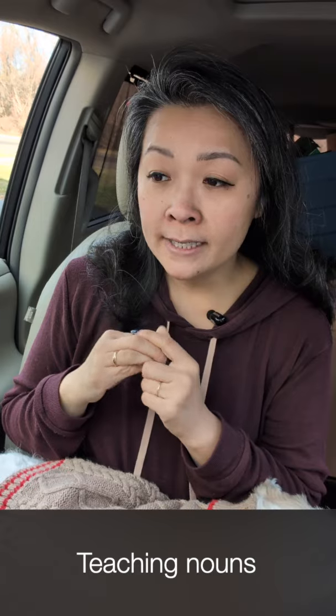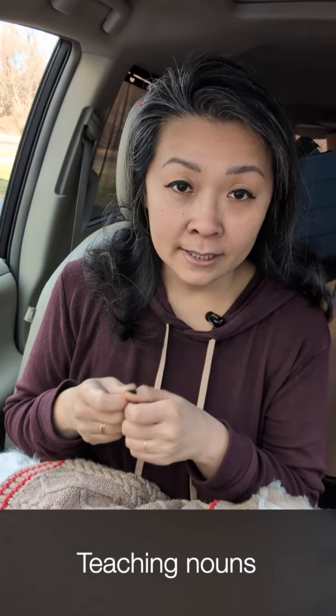Let's do this. So now it's time to start having your AAC user use the device. What we learned from my SLP is we had to do speech drills. They're not as intense as it sounds. The main goal is to have repeated attempts of using the target word. So if your word is a noun, those are the easiest to teach. They usually have a one-to-one association.